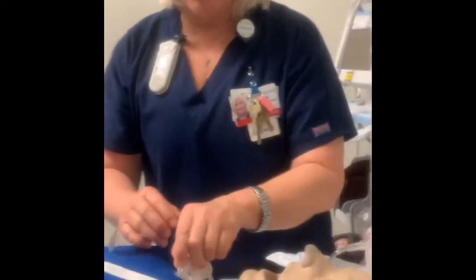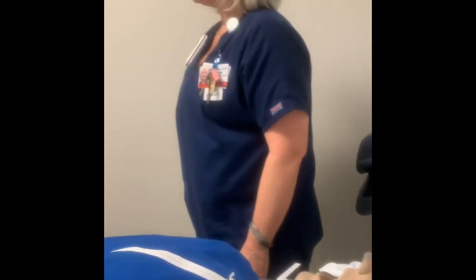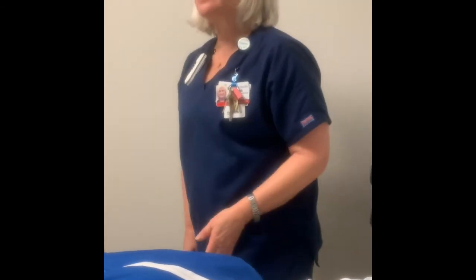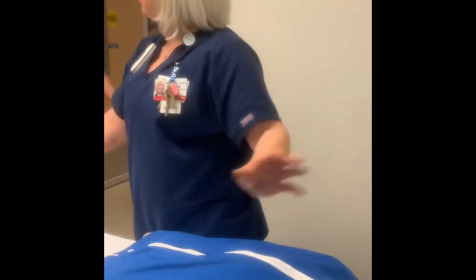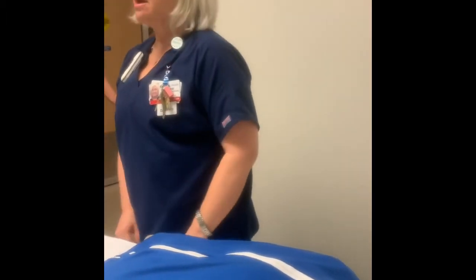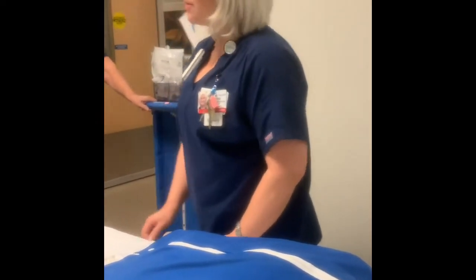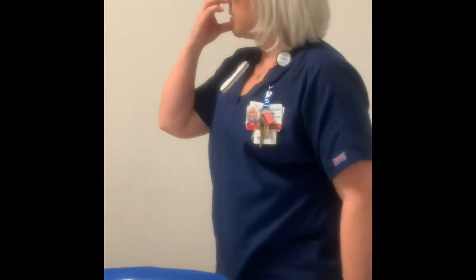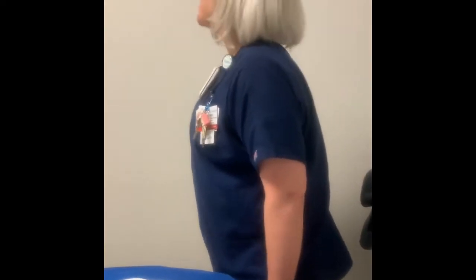So if my tube were to fall out and I've got a laryngectomy, where am I gonna ventilate? I've got a laryngectomy with a temporary trach in, but my trach fell out. You're recovering them and your trach falls out. What are you gonna do? But they're a laryngectomy. Don't you have to ventilate the stoma then? Absolutely. Would you ventilate up here? Is that an option? No, the larynx is gone, they'll come out the mouth.